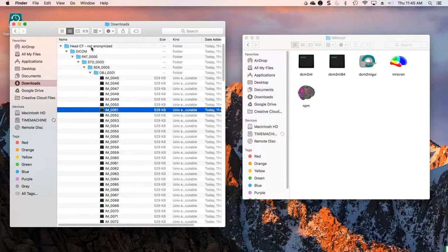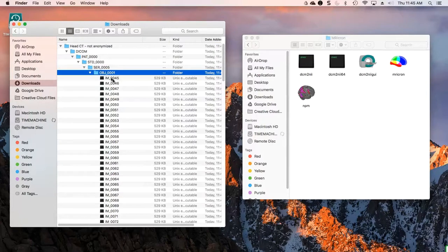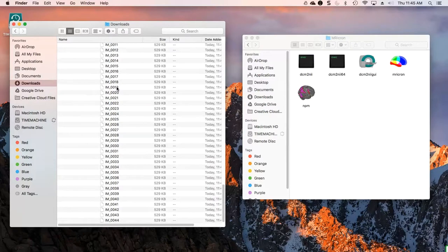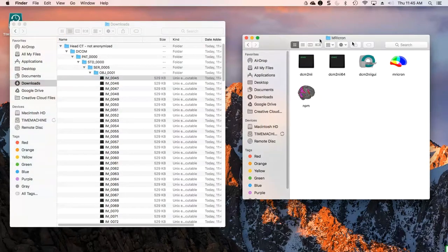Right here I have a head CT that I have downloaded off of PACS in DICOM format. You can see this is a single scan through the head and it's just a bunch of files that aren't really named according to what they contain — a little bit hard to tell what's going on and it's not anonymized. So to do this we're going to use the MRI-Cron tool, which is freely available — just search for MRI-Cron. We're going to use the DICOM-NII GUI software package in the MRI-Cron tool.